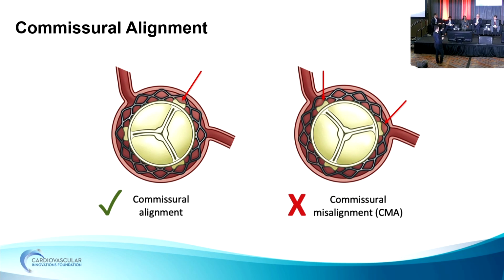Yeah, and second question, how do you know this is not a valve leaflet? So the height is pretty high. So we know we have at least 14 millimeters. So we know that for the native leaflet, anything more than 10 millimeters is a safe zone. So your native leaflet would not come with that high. It also wasn't a lot of calcification. So we felt that a small calcium chunk from the left coronary cusp should not be blocking it, because there was not a lot of calcium sitting there, although it's a possibility. At this point, we don't know what's really causing it.